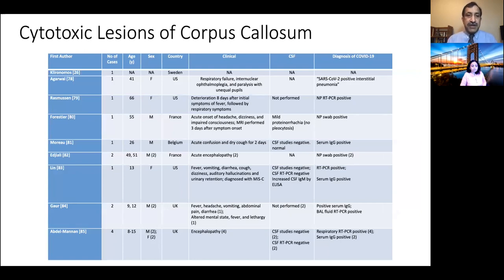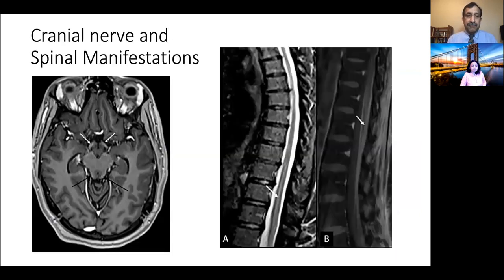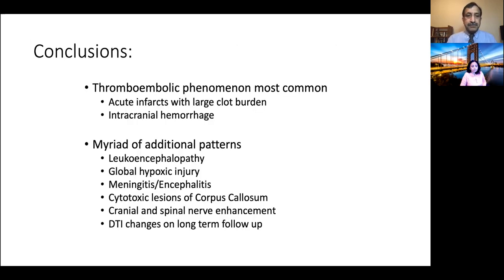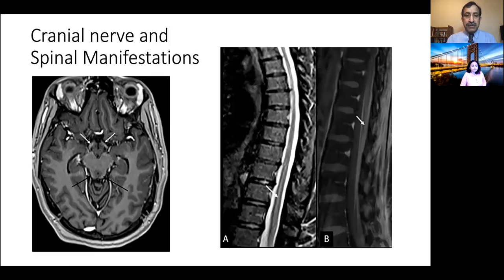Syndromes which have led to cytotoxic lesions of the corpus callosum have also been described, summarized in Table 4. Findings of cranial nerve and spinal nerve enhancement were also described in the literature and seen in our set of images. Also of note, T2 hyperintensity within the olfactory bulbs was described in patients with anosmia, although no image was shown in our particular paper.